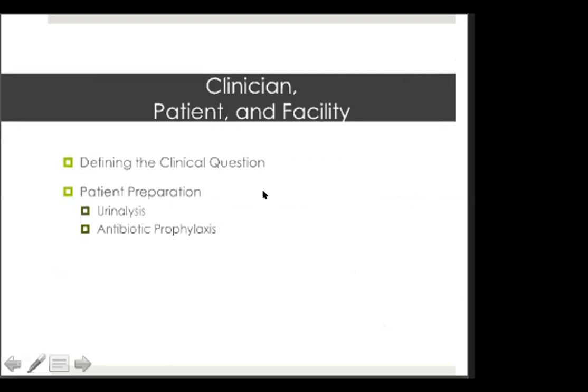So during the orientation, before the test starts, it is important to provide instruction to the patient.